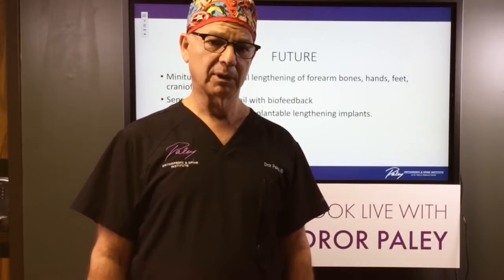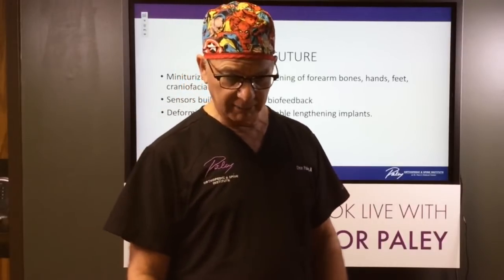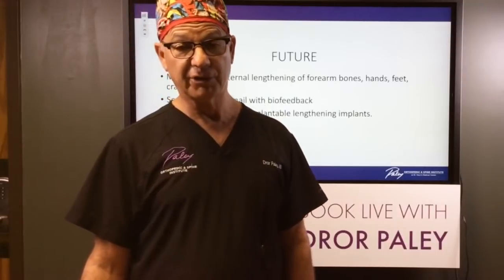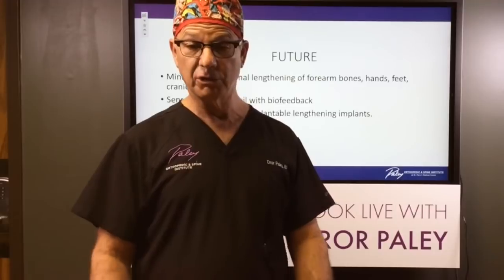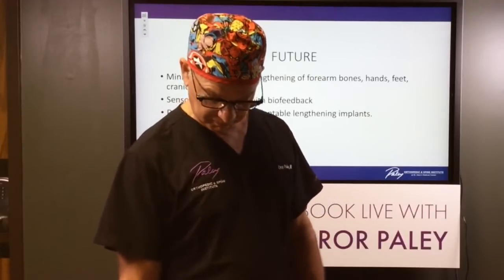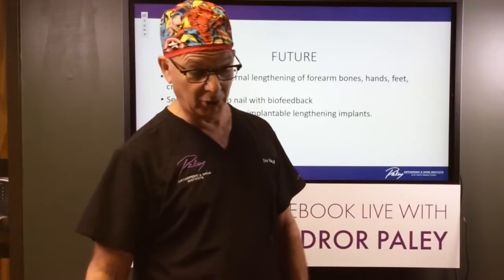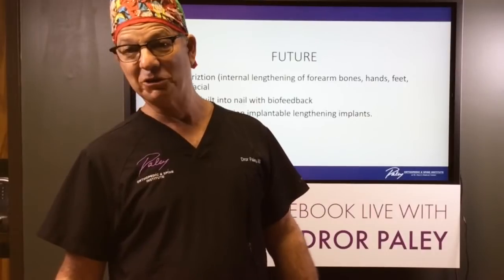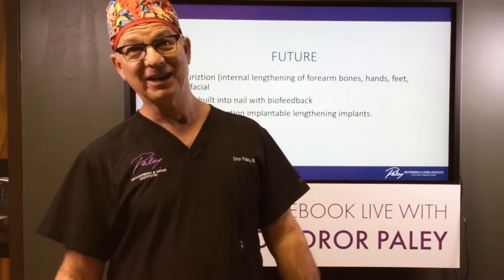And we use many external fixators to lengthen those. Our center does more lengthening for brachymetatarsia than probably any center in the United States. And we get them from all over the country, being treated here by a couple of us at the Institute. By the way, the same condition, which is a little less common and certainly less bothersome, is shortening of one of these bones, and it is treated the same way.